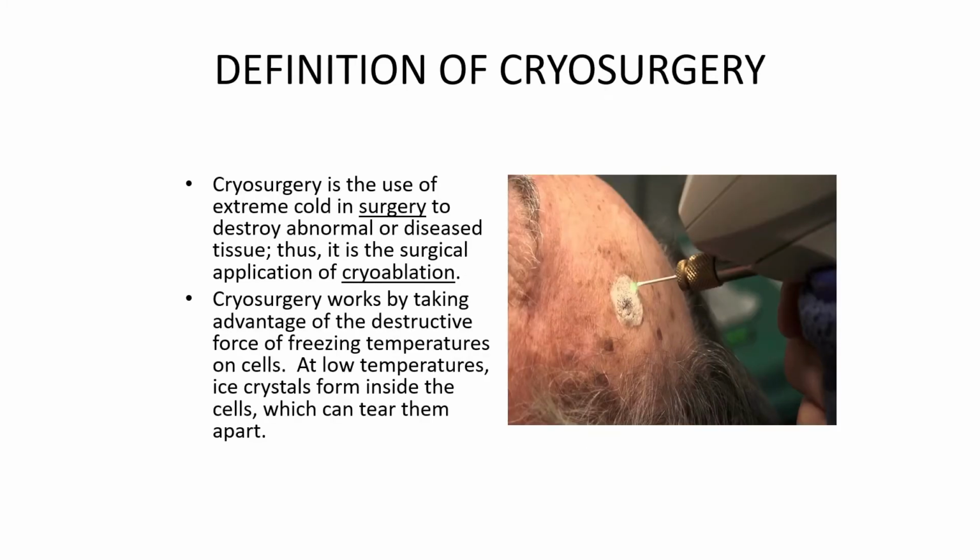First, we will begin with the definition of cryosurgery. Cryosurgery is the use of extreme cold in surgery to destroy abnormal or diseased tissue. Thus, it is the surgical application of cryoablation. Cryosurgery works by taking advantage of the destructive force of freezing temperatures on cells. At low temperatures, ice crystals form inside the cell which can tear them apart, as we can see in this picture.